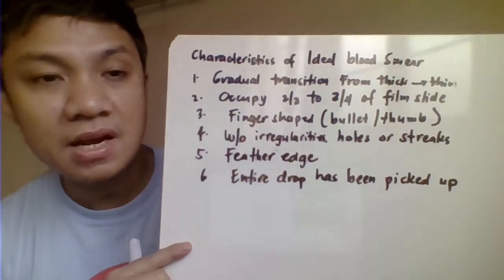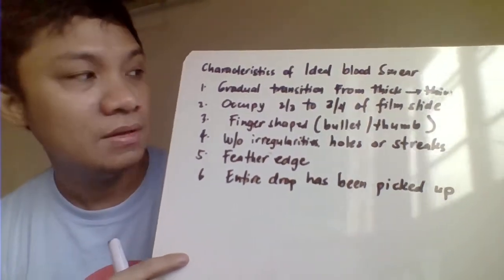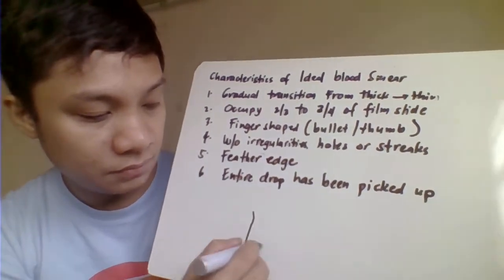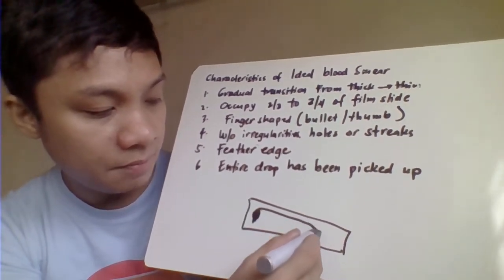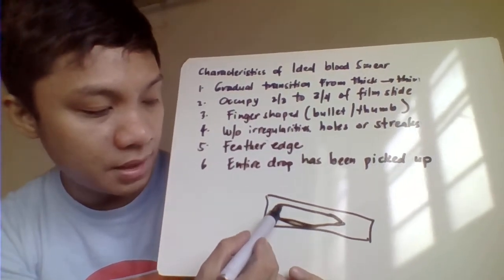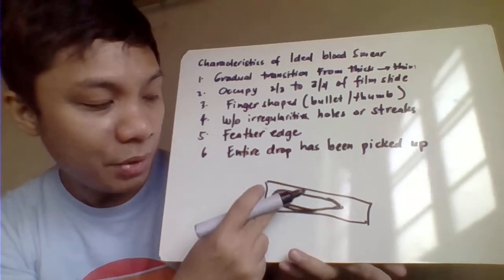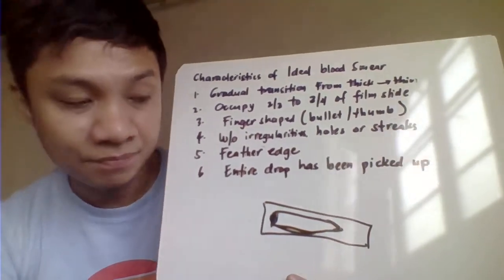Okay, then we have here the characteristics of your ideal blood smear or ideal blood film. So the first one, you should have a gradual transition from thick to thin. Okay, you start here, then... so most likely, gradual transition, so dapat you start here on this area, thicker area, and should have a gradual transition to thin area. Di pwedeng thick, tapos may thin, thick, thin, something like that.